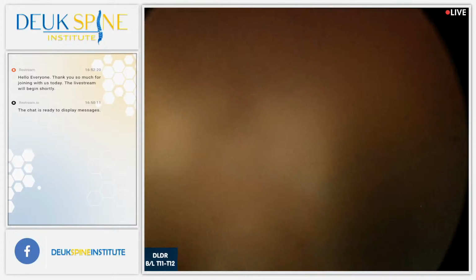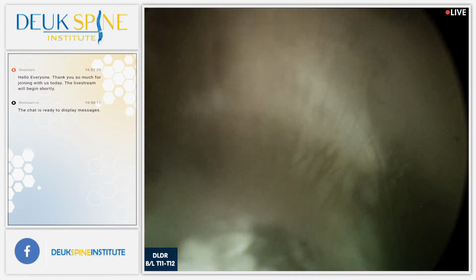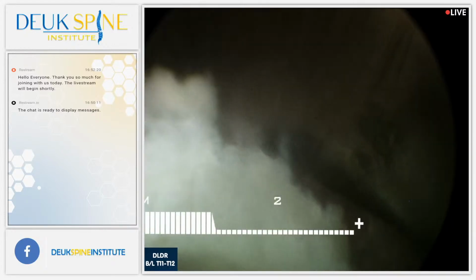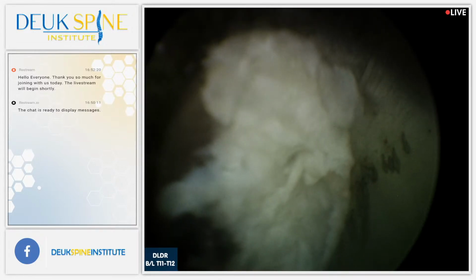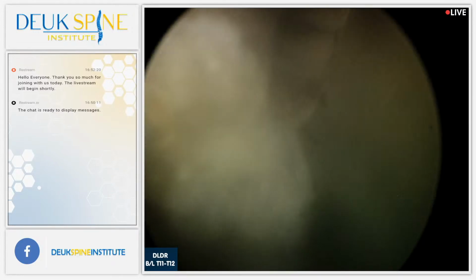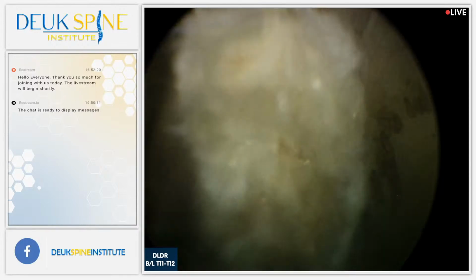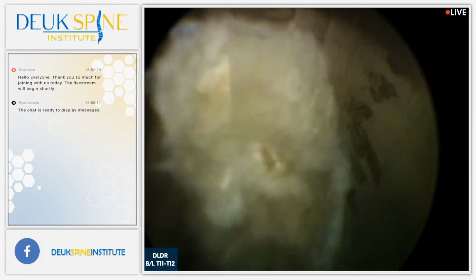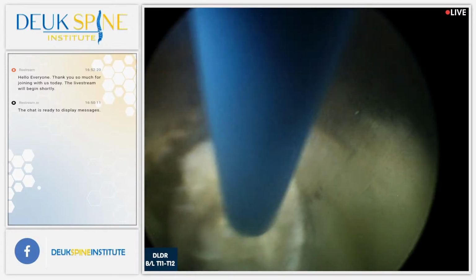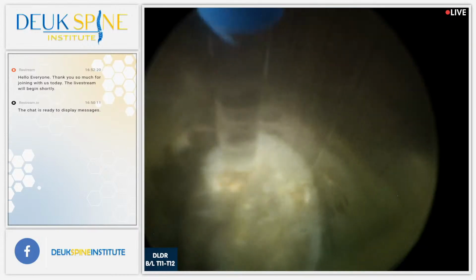Did you know that we have the short lumbar? Can we use that? We can. It's not the issue, though. No, I know, but not in this case. I'm saying, why is the view either too zoomed in or something? I don't think the length of the scope's the problem. I think it's the width, if anything. She probably needs something in between short and long. And I just need this laser to get to the area I need it to get to. This is the herniation right here, guys. I can't get to 12 o'clock. It's the other direction, that's why. Pull towards you. Better? That's better.